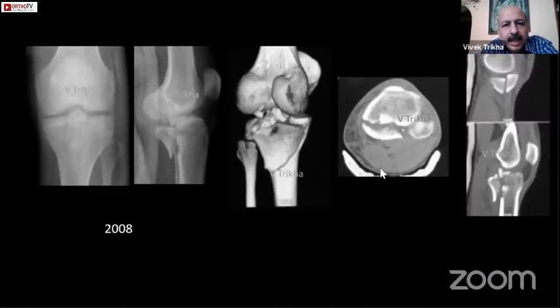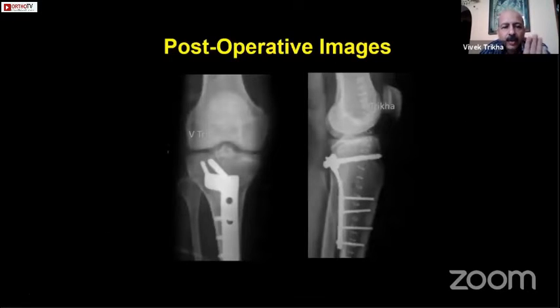The third thing is these fractures. Again, you see a type 4 fracture, but how the CT is helping us to understand which is the fracture site, which is the plane and the apex of the fracture, and where to put in the plates. Here now that fracture has shifted dead posterior. You can see that the plane has become coronal in front instead of sagittal. And that's what now your plate also has to go dead posterior for this. So that's how you do for the type 4 fractures.